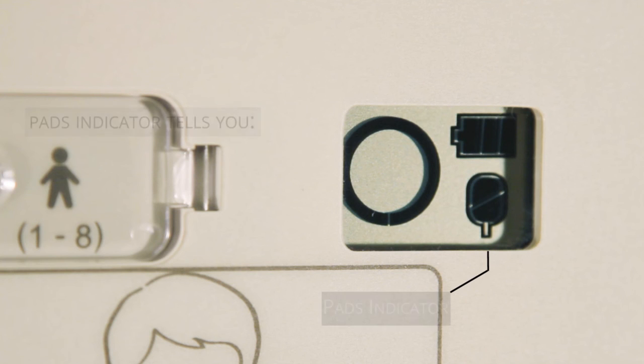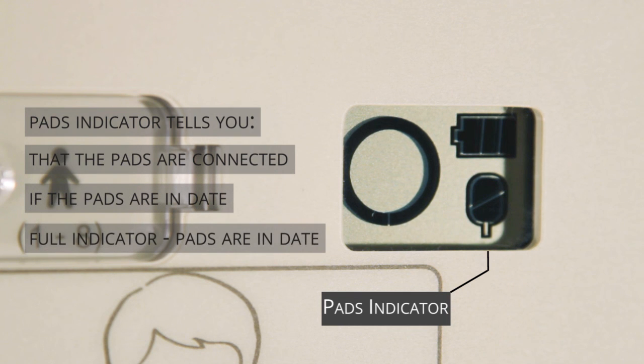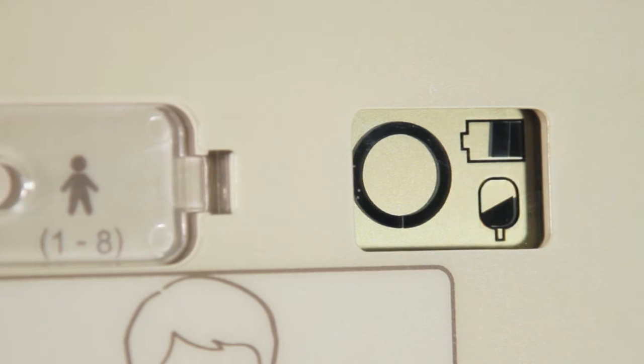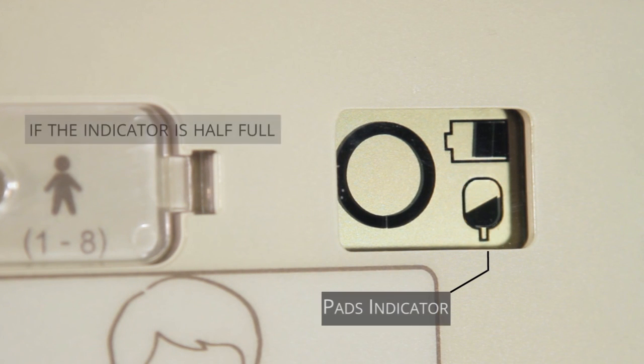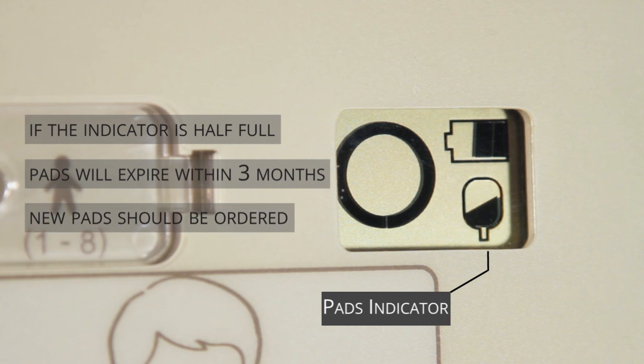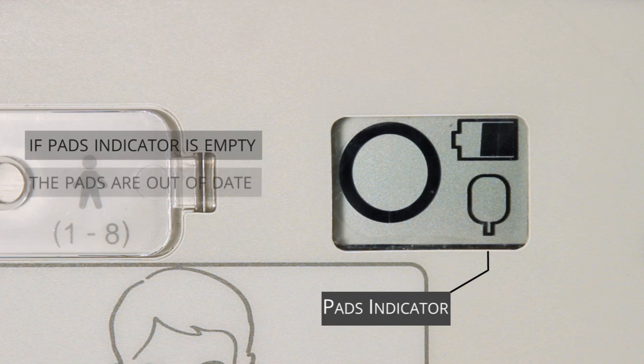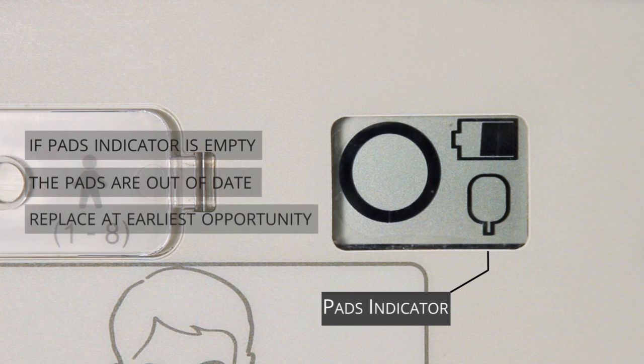Thirdly, the pads indicator tells you that the pads are connected to the AED and whether they are in date. If the pads indicator is full, the pads are in date. If the pads indicator is showing as half full, the pads will expire within three months — new pads should be ordered. If the pads indicator is empty, the pads are out of date and should be replaced at the earliest opportunity.